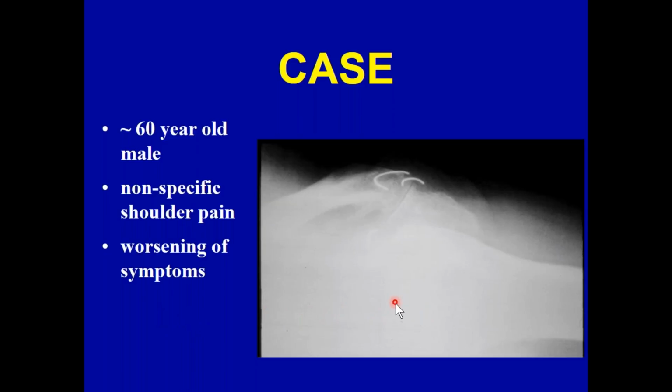If you remember the particular point from the previous discussions, we said the first thing to fix is the KVP. If you look on your technique chart, whether it's analog or digital, for a shoulder x-ray, the optimal KVP clusters around 70 KVP. If it's anything less than that, you have a good chance that the film will be underexposed, given that the MAS is within the normal range.